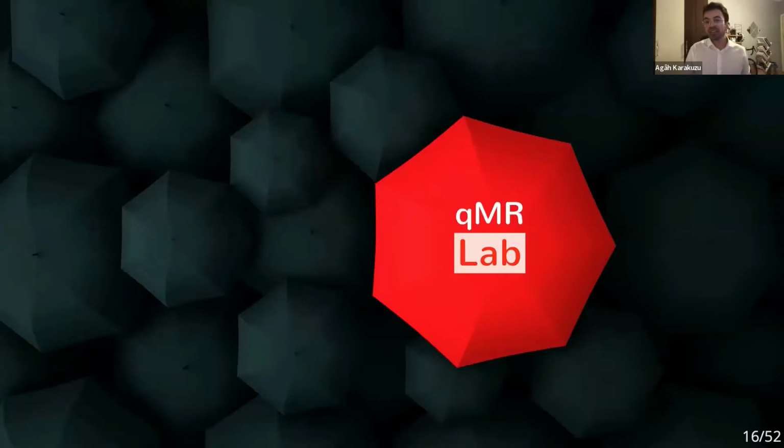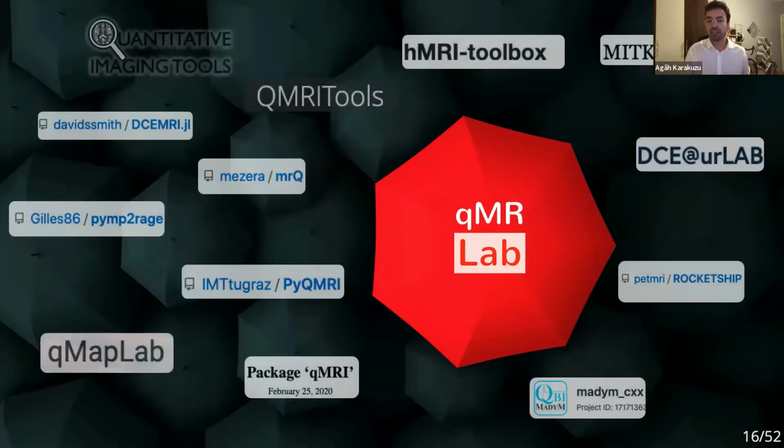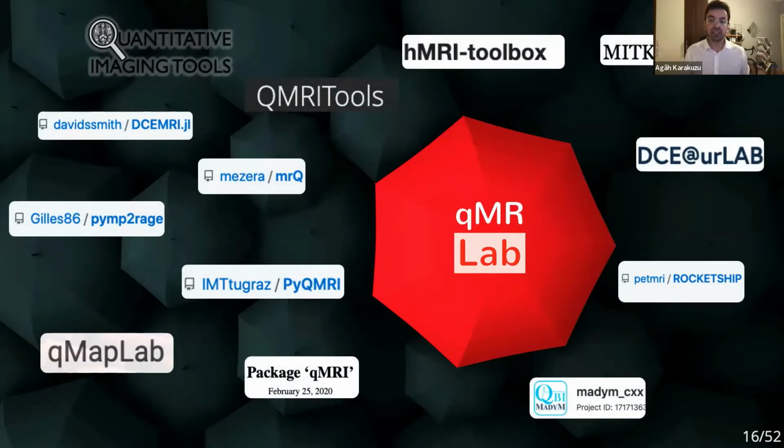So when I started working on qMRLab, there were 4 to 5 open source packages for quantitative MRI, but as of today, there are at least 13, and this excludes the packages that have quantitative MRI as a submodule. And these are developed in a variety of languages with various applications in mind. And based on my observations, most research groups prefer using the software developed by their institutions, which makes total sense and certainly much better than developing and using in-house code.